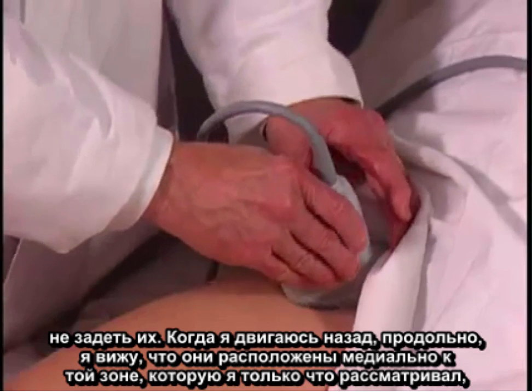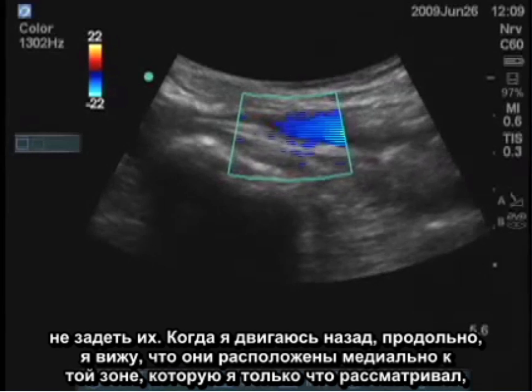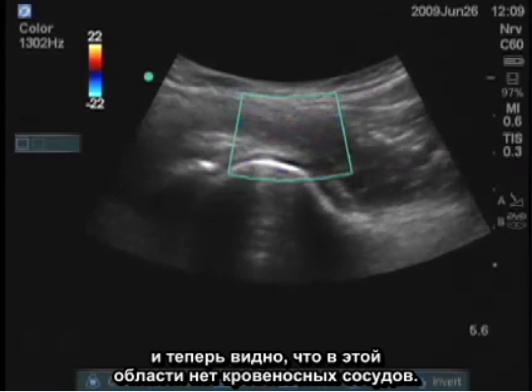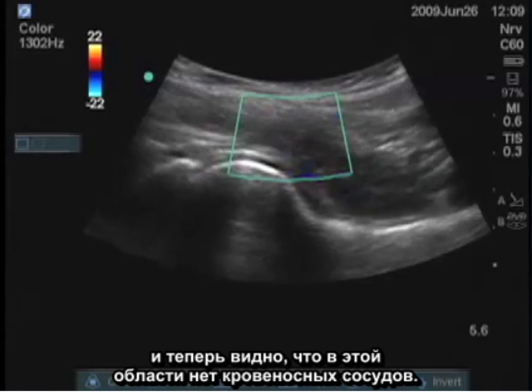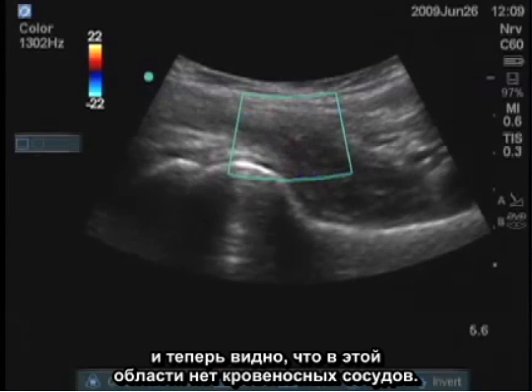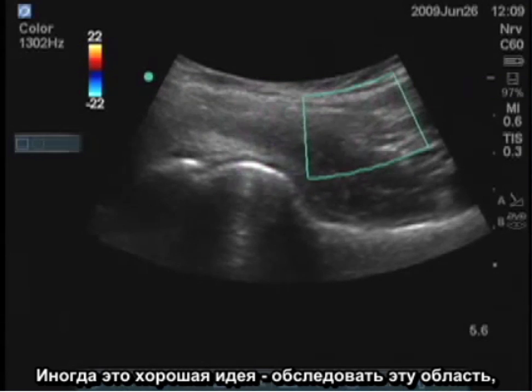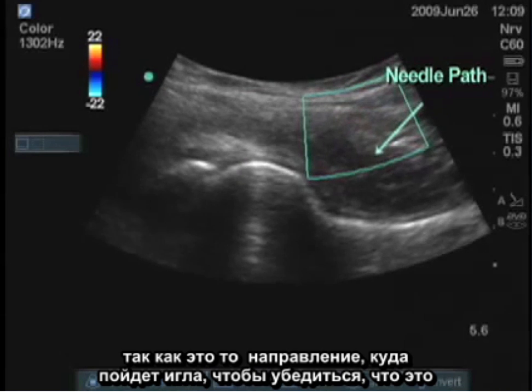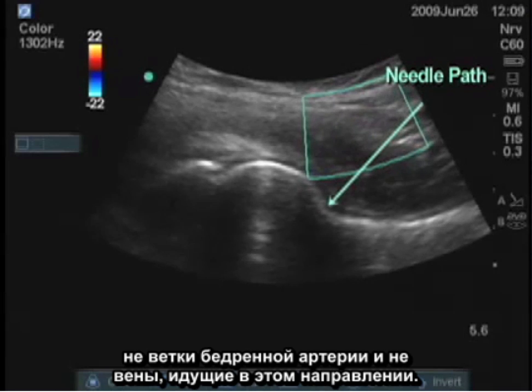When I turn back longitudinally, I see that those vessels are medial to where I was looking before, and now that area that I've examined does not have blood vessels. Sometimes it's a good idea to look in this area because that's the direction the needle is going to be coming, to make sure there are no branches of the femoral artery or vein going in that direction.